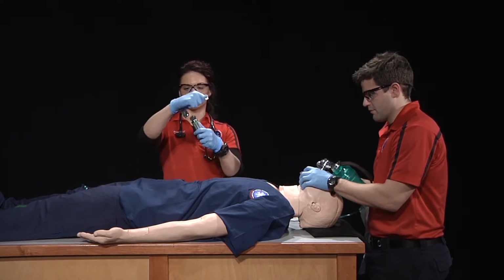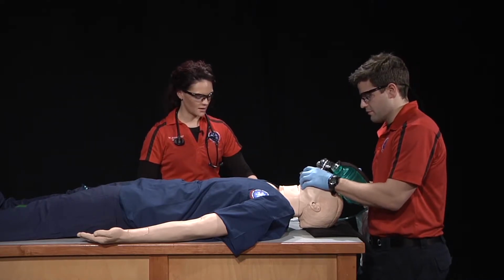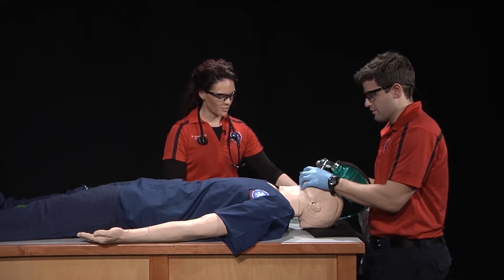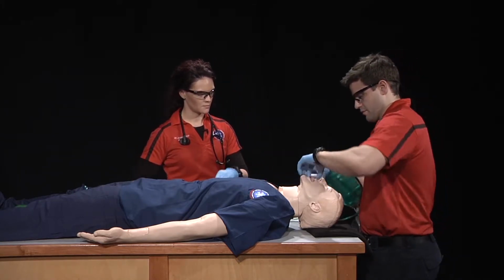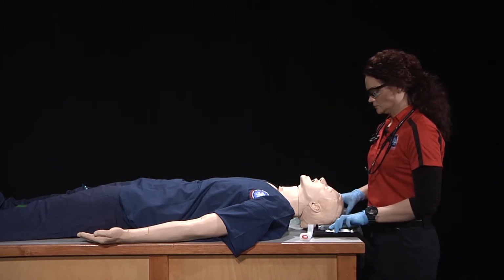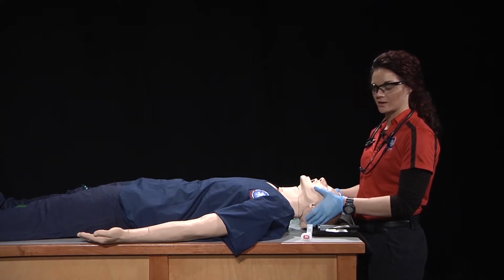I'll need to attach my laryngoscope blade to the handle, as well as assemble my ET tube. After my equipment is prepared, I'll have my partner remove the OPA. I'll now position my patient's head appropriately.